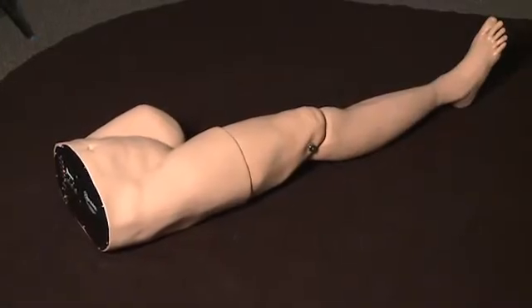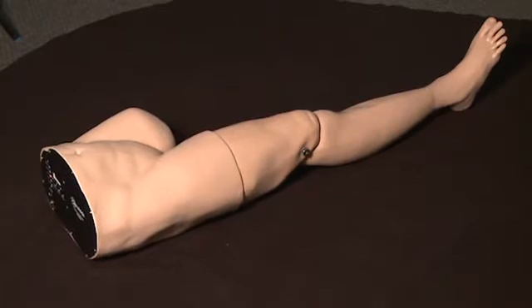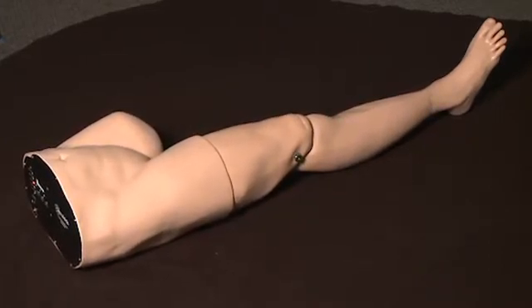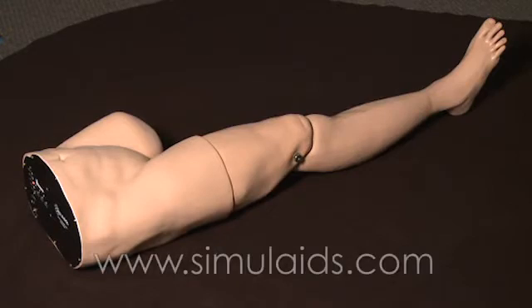We're here to introduce to you the new product by Simulaids called the Traction Splint Trainer. Its item number is 031. You can find more information about it on our website at www.simulaids.com.